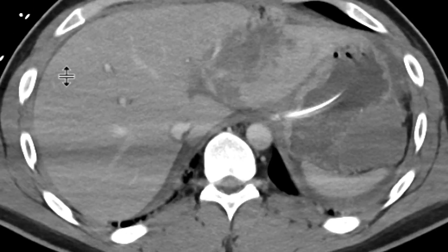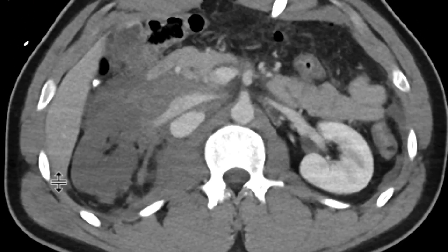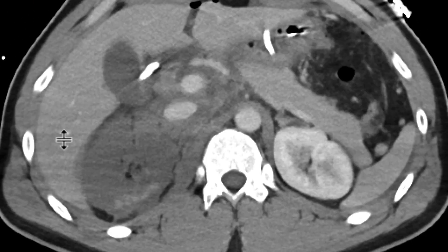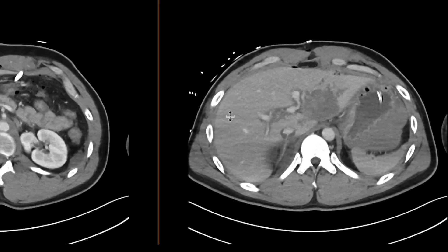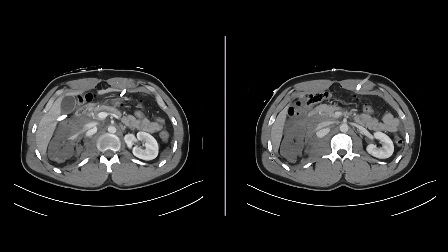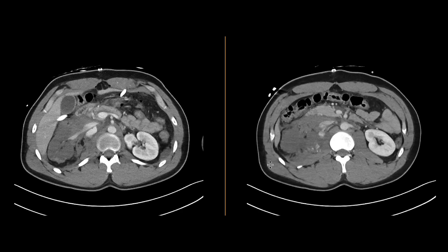We have a delayed phase that we obtained as well that shows these findings really nicely — really extensive injury with this fistula formation in this patient who had a gunshot wound.